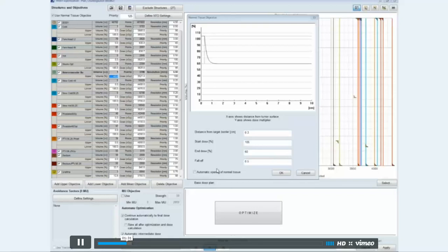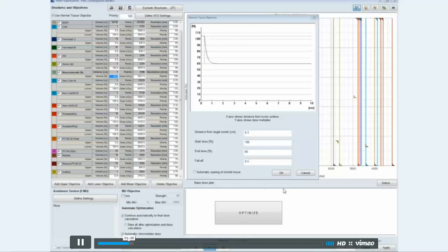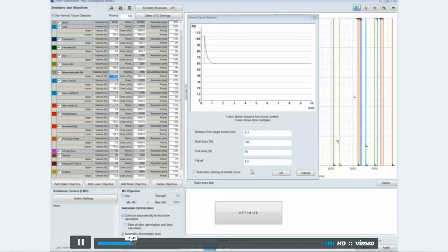I experimented with some different numbers in the NTO, and this is what I ended up with: a distance from target border of 0.3 and a falloff of 0.5. This seemed to really help both my coverage, my minimum dose within the PTV, and my conformation number.